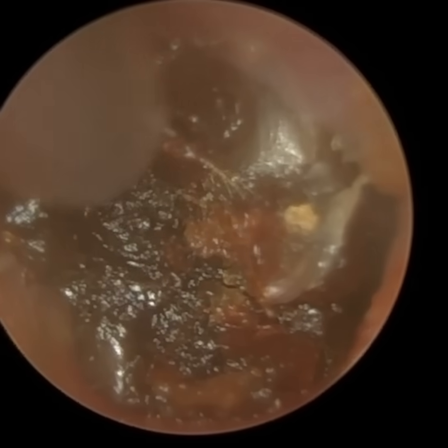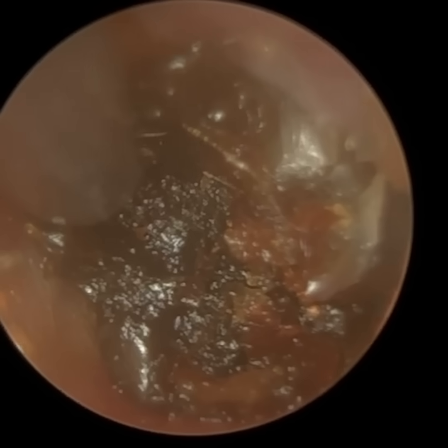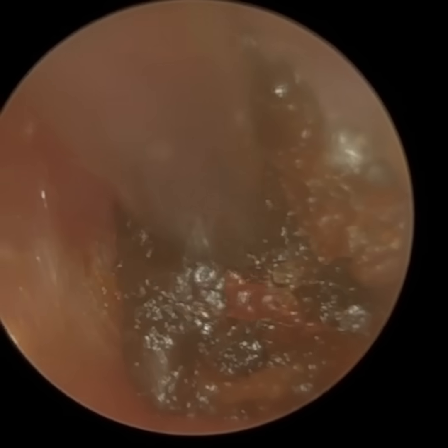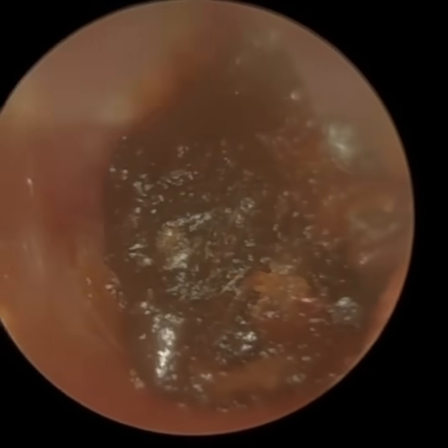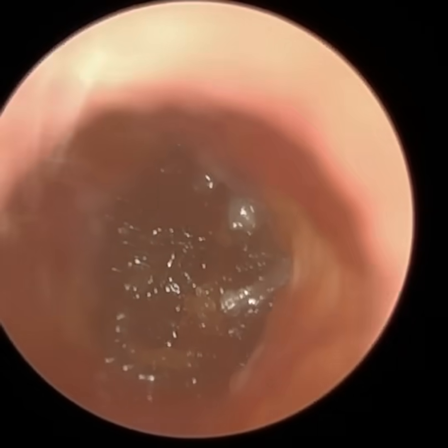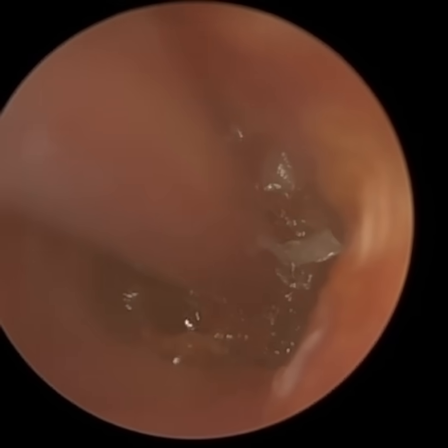But if we go away from the term Zollner, I'm going to call it a 14 gauge. So it's got an outer diameter of around 2 millimeters and an inner diameter of 1.7. And that's because that suction tip barely fitted in that narrowing. In addition, when I was suctioning, the suction probe was actually causing the canal to collapse, and that can be painful.